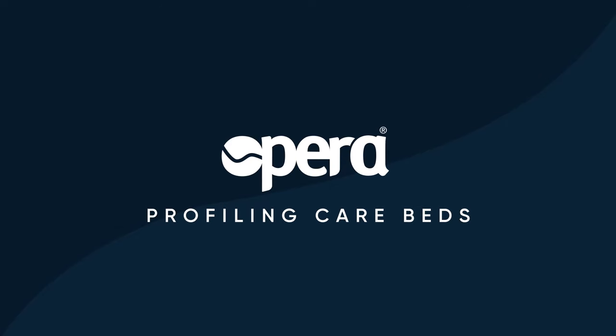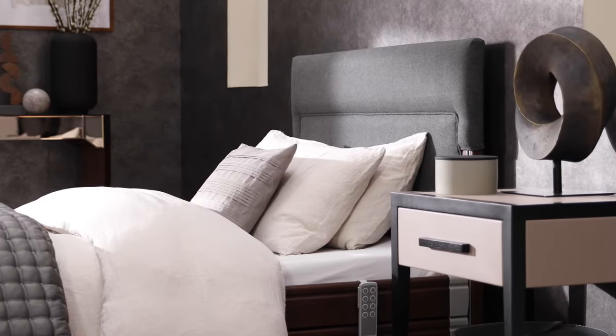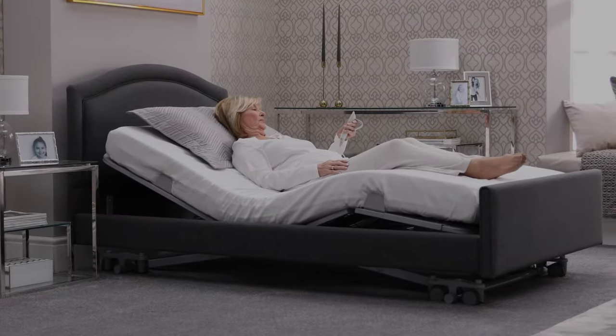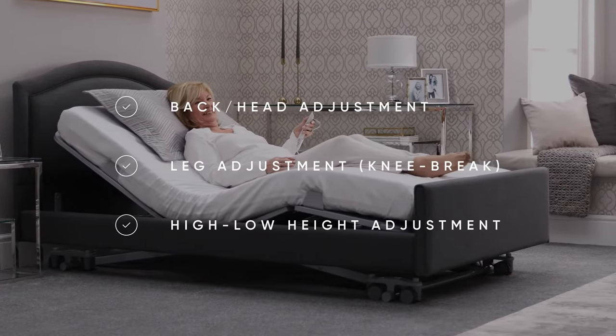We are a leading provider of profiling care beds, helping care environments and people in their own home for almost 20 years. A profiling care bed has an elevating backrest, a knee break, and the whole bed raises and lowers.